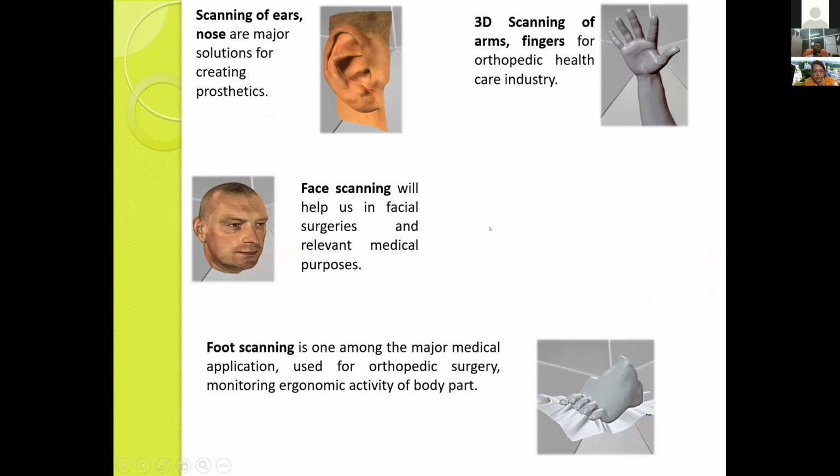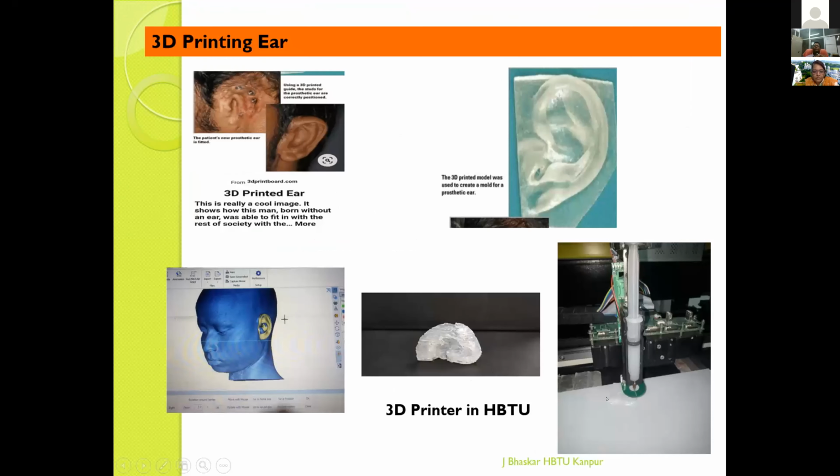Okay, so these are some other examples of scanning ears, which ma'am, you are also working in this area, and scanning of hands, facial scanning, and foot scanning. Finally, as already shown here, you take those things and create an artificial ear for implanting purposes.